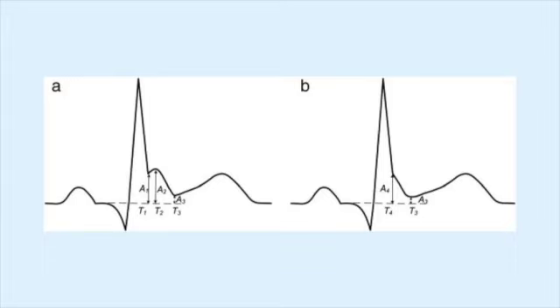The reason I'm going to define it this way is I was taking a preparatory test when I was studying for my paramedic, and the question referenced WPW, and they were asking what would the EKG present with, and the answer was the slurring of the QRS. Sure, the delta wave, but it didn't want to give you delta wave. They said what would be some of the EKG findings, and the correct answer was slurring of the QRS. I thought that was pretty neat.